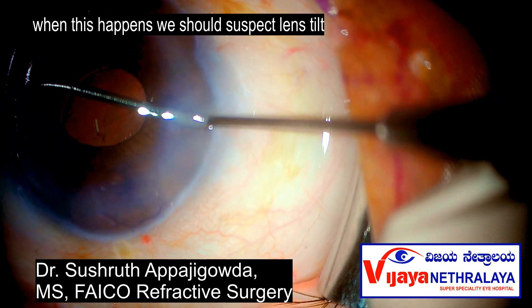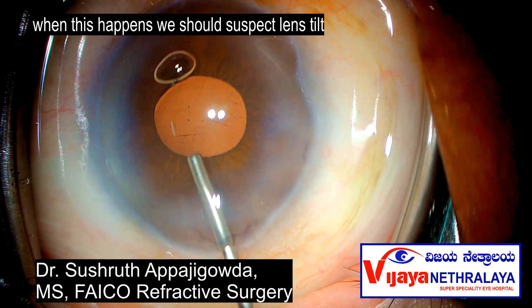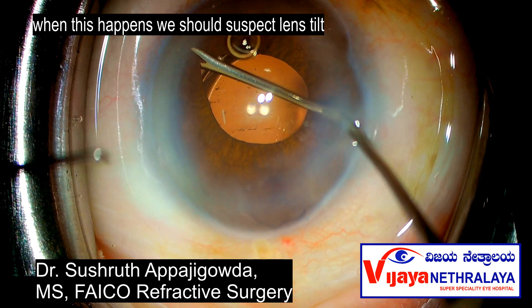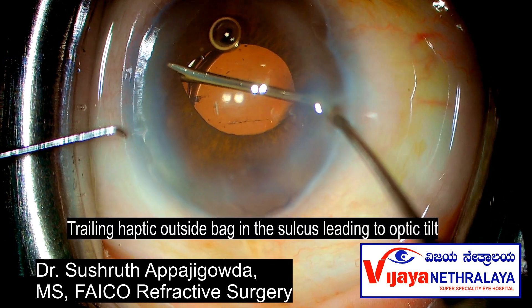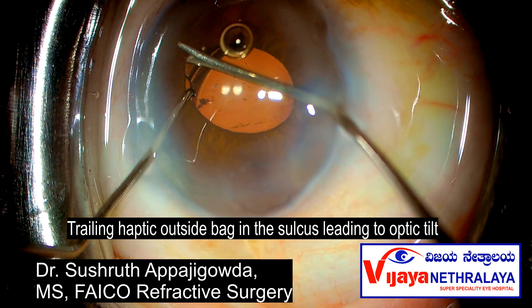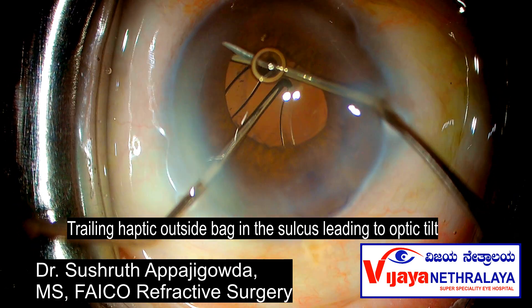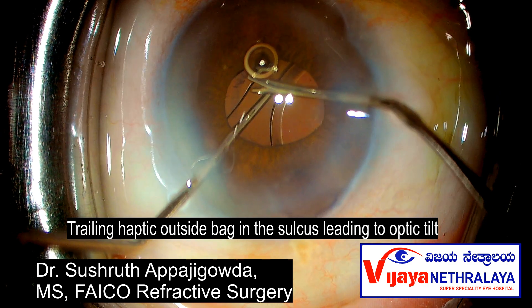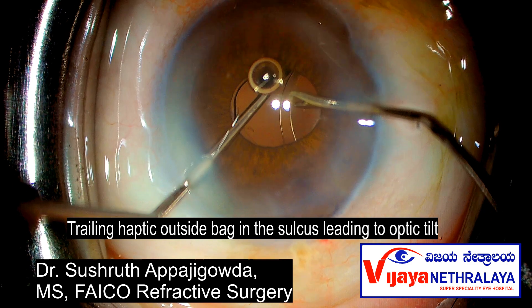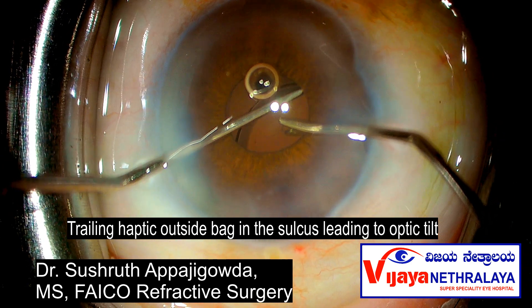I make a blunder here, going in with an instrument when OVD is removed to check for lens tilt. I quickly realize my mistake, inject OVD again, and there it is — the reason for the improperly aligned Purkinje images. This is a mid-dilated pupil. The trailing haptic was not properly placed in the bag, leading to a major lens tilt. Now the lens was properly placed in the bag.